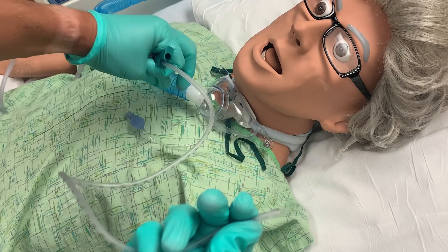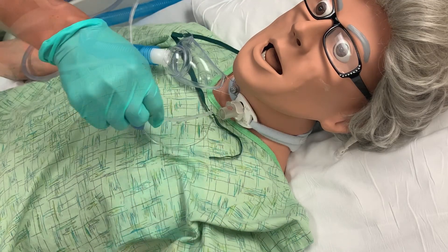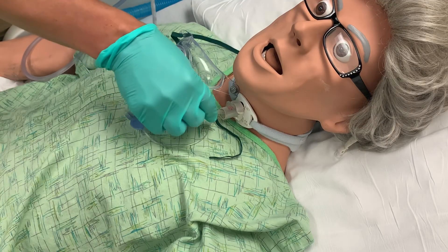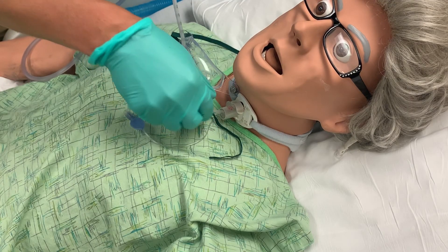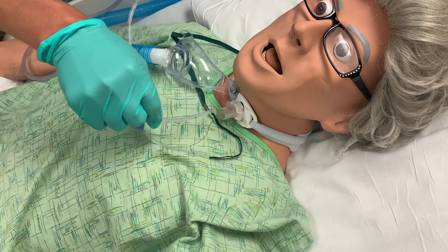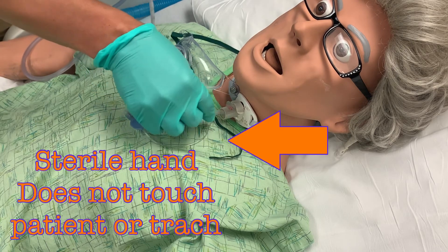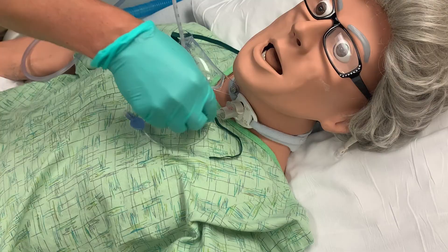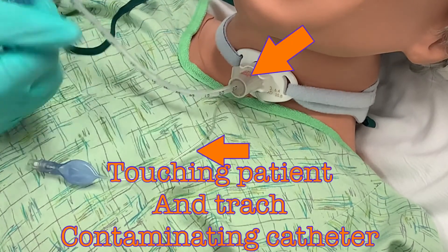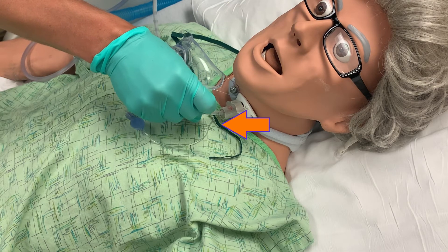With your non-sterile hand, move the collar away from the tracheostomy. With your sterile dominant hand, insert the catheter into the patient's trach. Advance smoothly until you feel resistance or the patient begins to cough. You must not apply suction to the catheter while inserting, so do not cover the hole of the adapter at this time. While inserting, be careful not to let your sterile hand or the catheter touch the patient, as this could lead to contamination of the catheter and the introduction of infectious agents directly into the airway. When the patient coughs or you meet resistance, retract one centimeter.